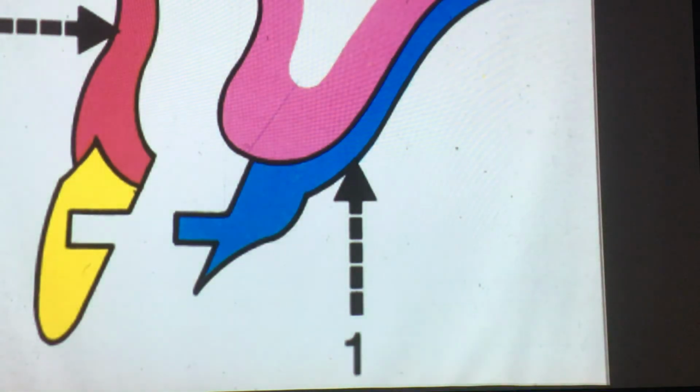This is something creative in a picture from Davenport's textbook. It shows an attachment of the anterior flange. But what I want to talk about is soft tissue undercuts. If this denture goes in the path of insertion as shown, number 1 would represent the path of insertion, that means the denture will go in this way. And you will have all this undercut to the labial flange because there's a huge undercut. So now, to minimize this undercut, maybe I need to change the path of insertion to go this way to minimize the undercut of the flange.